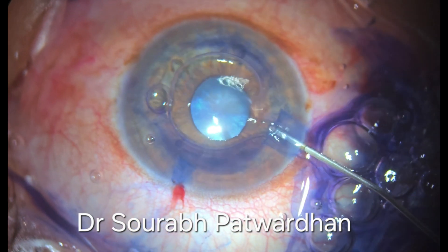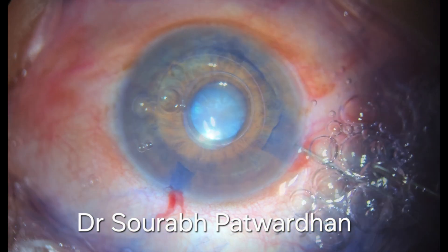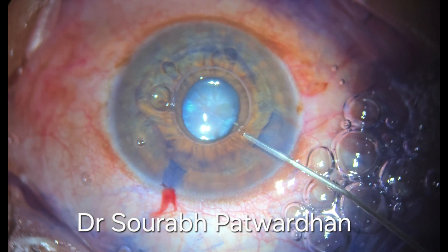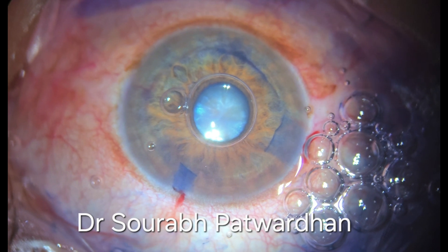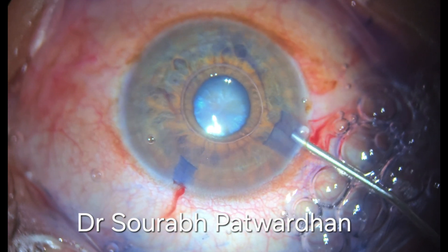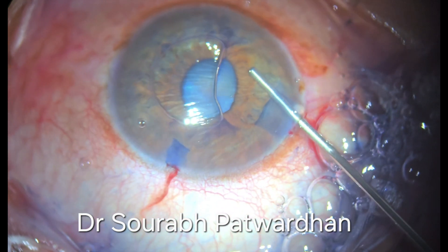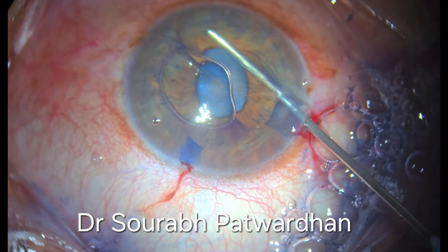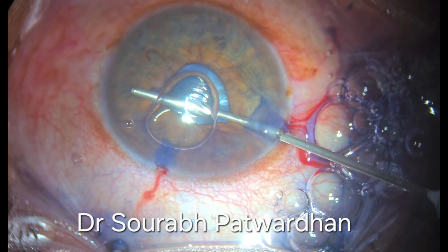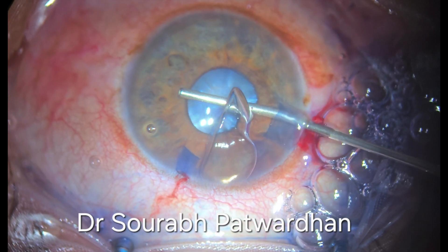It is evident here that if I push the fluid too forcefully, the iris can prolapse anytime. So I am taking care that I wash off the dye very gently. And then I am going to use the heavy dispersive OVD Hylucote here. This is a combination of chondroitin sulfate and hyaluronate. As you can see, I am pushing this OVD from periphery to the center. This avoids trapping of any fluid under the iris.